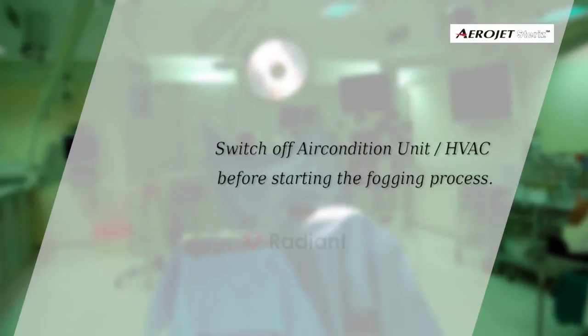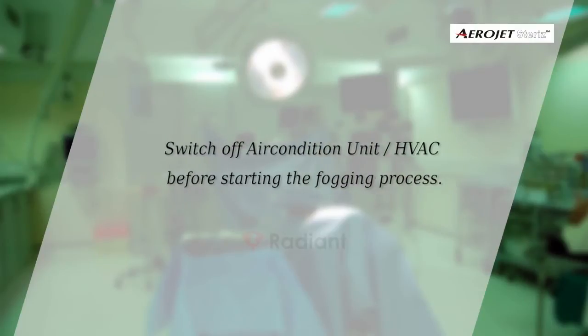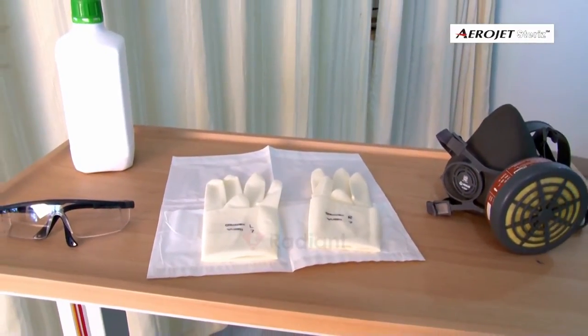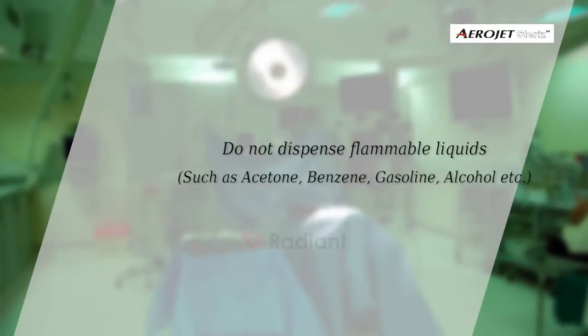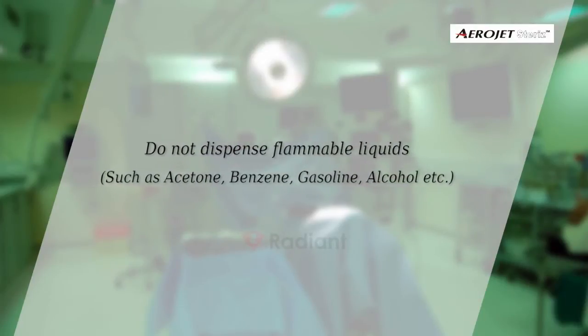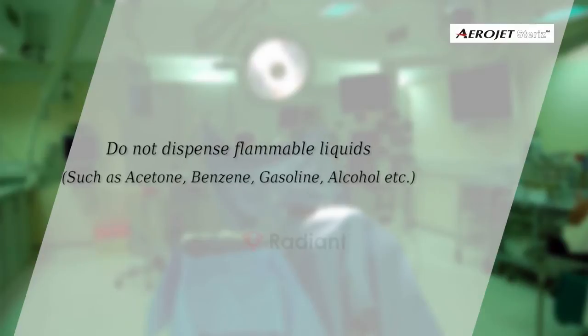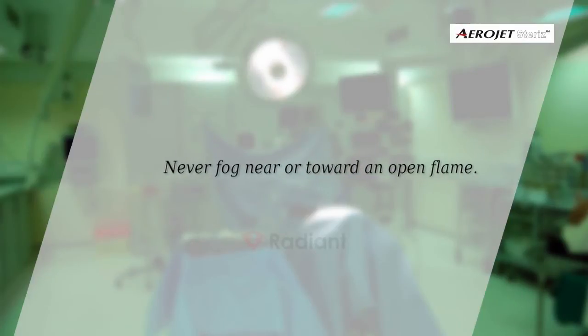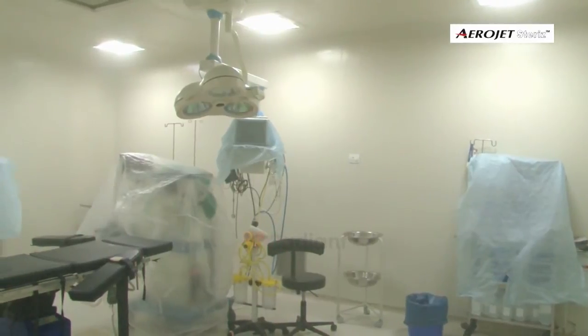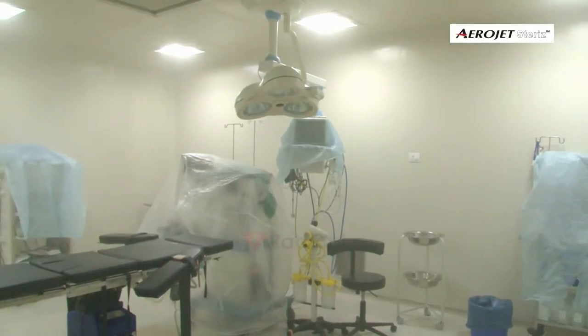Always switch off the air conditioning unit before starting the process. Use necessary safety equipment recommended by the disinfectant label. Do not dispense flammable liquids such as acetone, benzene, gasoline, or alcohol. Never fog near or toward an open flame. Cover electronic equipment with linen or plastic covers.